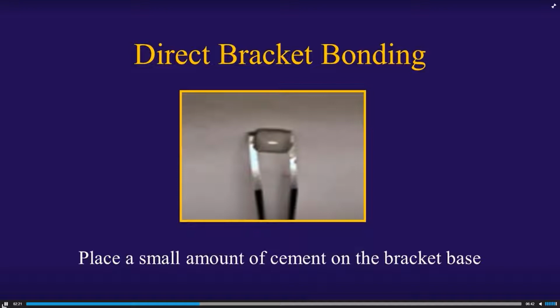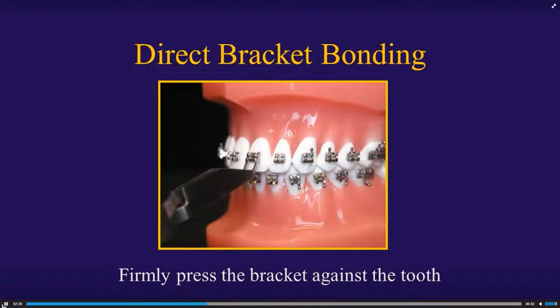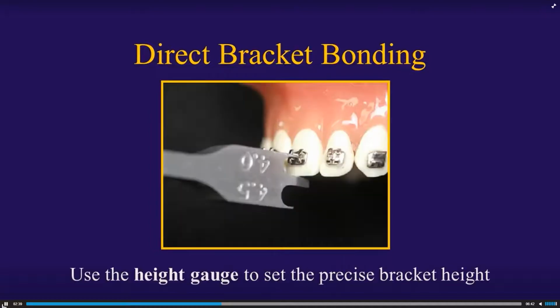You place a small amount of orthodontic cement onto the back of the bracket. Then you're going to press the bracket against the tooth nicely and firmly, okay, to make sure it's really seated against the tooth. Then you're going to squeeze that reverse action plier to let go. Now you're going to come in with that bracket height gauge so you can set that precise height of the bracket on the tooth.